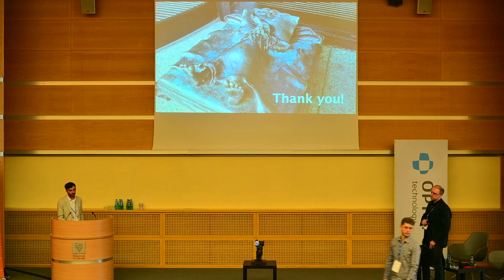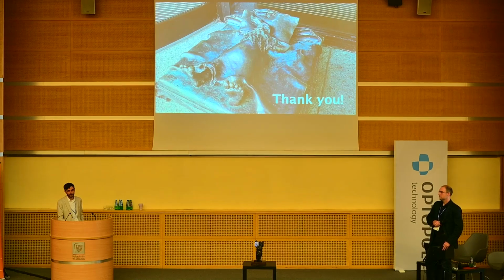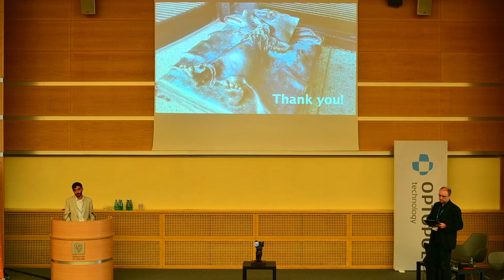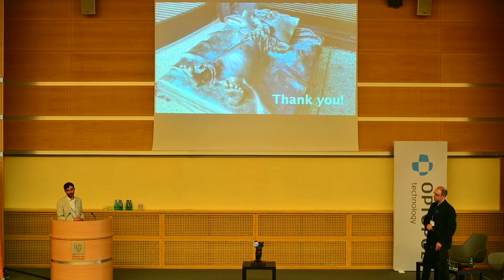Just a short question. Following Nida's question, how do you think is the OCT at longer wavelengths, like 1700? Does that make sense for eye imaging? Any applications to see through the sclera? Well, if you use light at longer wavelengths, then a lot of the light will be absorbed by the water in the eye as it travels through centimeters of eye. So you would have to use great care. I think it's possible to perform imaging of the sclera at the posterior pole. If you want to image the sclera at the anterior eye, of course that's always possible. And I think there it makes sense to use longer wavelengths.